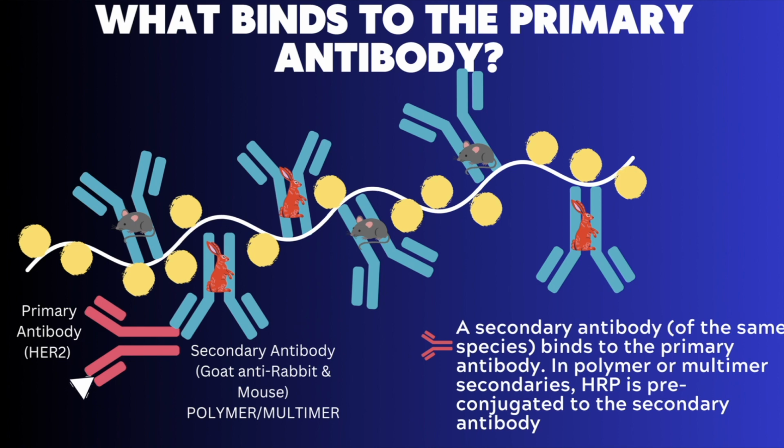This entire area right here that I'm circling with the pointer is a more modern method of antibody detection. IHC did not start out this way, and there are definitely simpler methods. However, I wanted to concentrate on what is happening in clinical laboratories current day. So, automated IHC machines like the Leica Bond, Dako AutoStainer, or Omnis, and the Ventana Ultra are using these types of technologies. And this is the type of secondary antibody conjugation that you would use in a modern clinical laboratory.